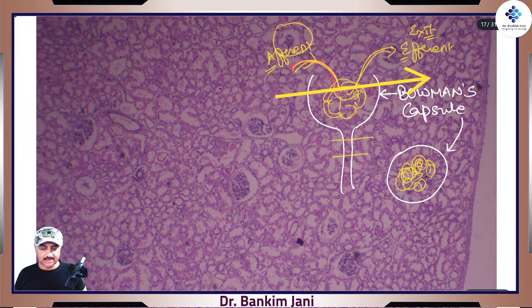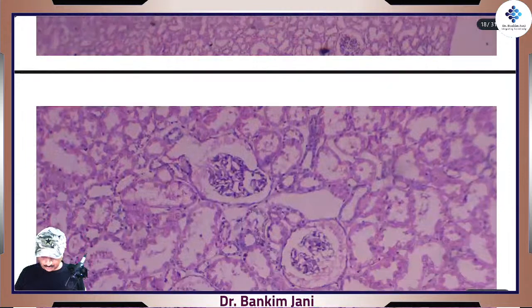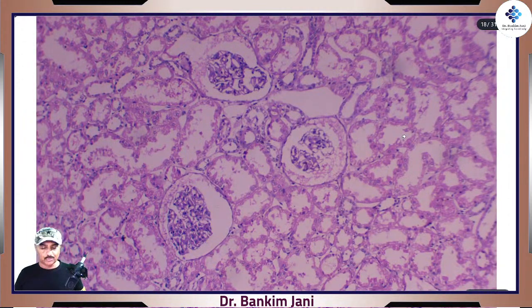Now, because this is just 10x, visually you'll have the idea that this is how it looks. But as we zoom, things are very cool. See, so beautiful. Now, no doubt about it. You might be tempted to look at some other areas. There are some different types of cells, and we'll come to that. But right now, focus on this one.